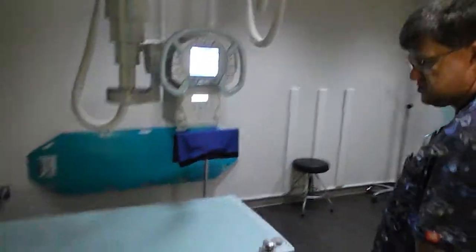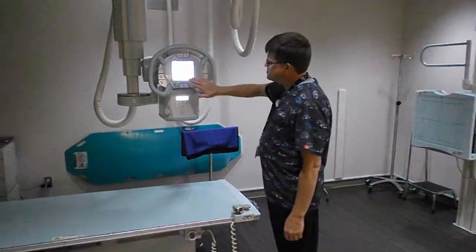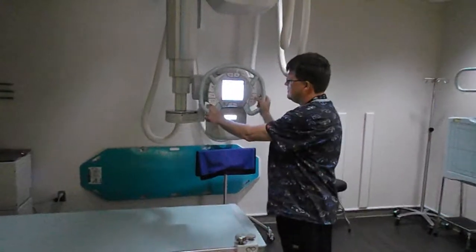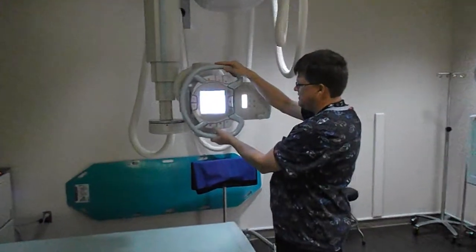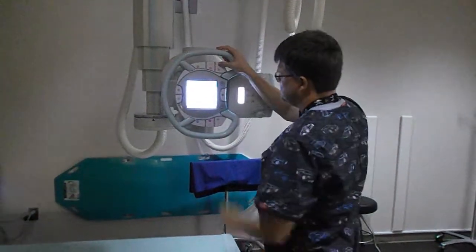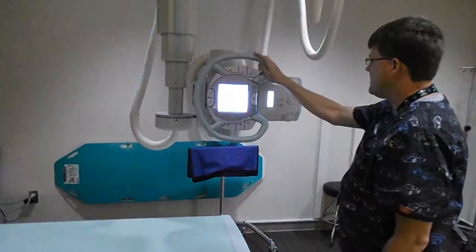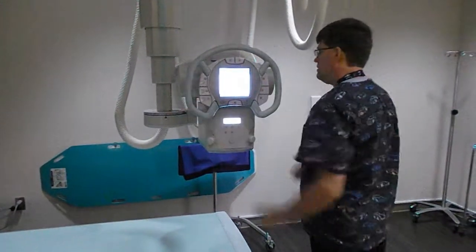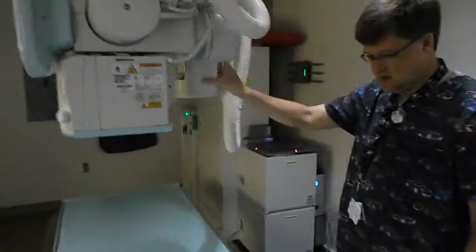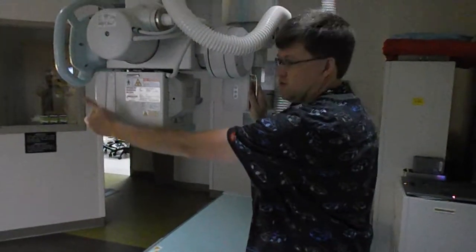This is our Shimadzu room. Both our ER rooms are the same. This tube — all these controls right here are for all your different movements for the tube. You can also move it in this direction as well. This is your all-free so that you can just move it anywhere you want. The cool thing about these tube rooms is that we also have controls back here so you can work with your patients on this side of the table and still control the tube from this side, and you can still reach your collimators here for collimating.